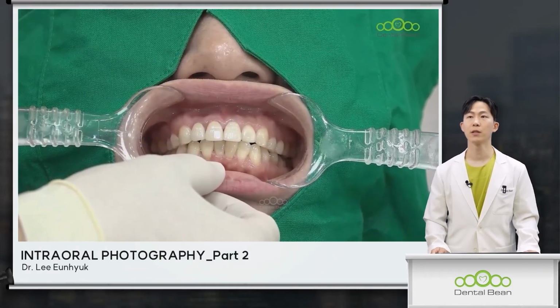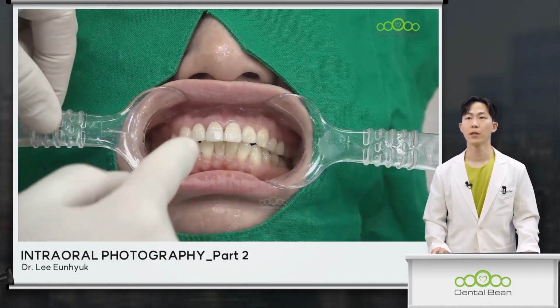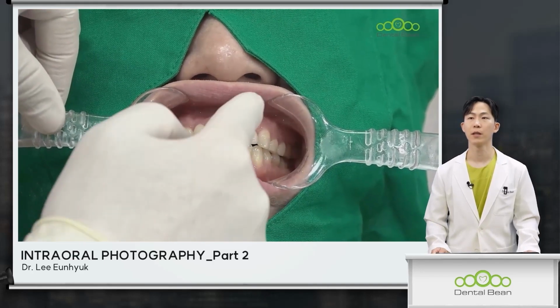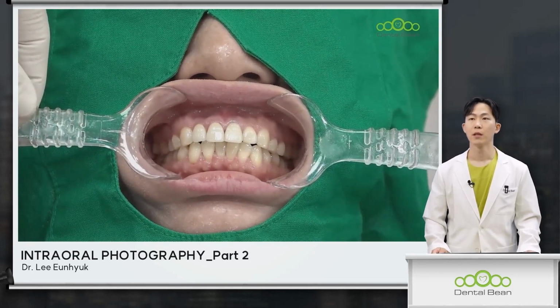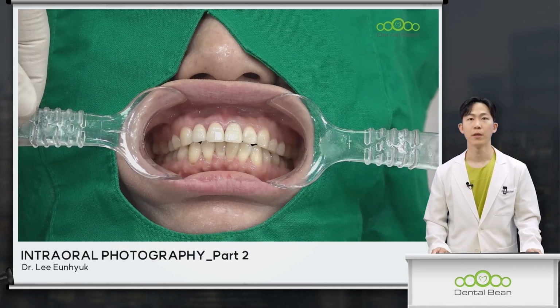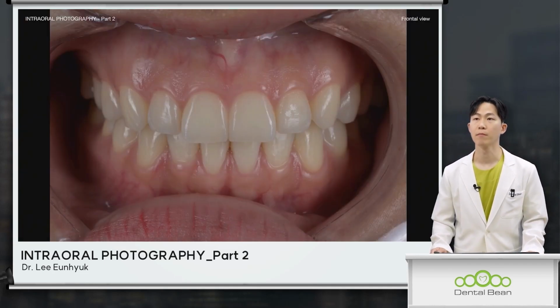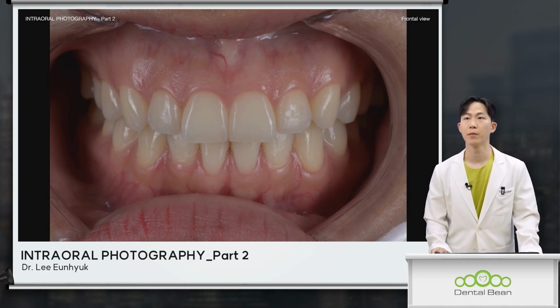There are situations, as you can observe in this video footage, where both the lower and upper lips may unfortunately tend to sag or droop down significantly. This often occurs when the patient's lips exhibit a certain level of looseness. This phenomenon occurs when the patient has a relatively large mouth opening and the lip tension is somewhat relaxed, allowing the lips to become a bit loose. In such instances, as demonstrated, the patient's gums are quite frequently obscured or concealed by their lips.